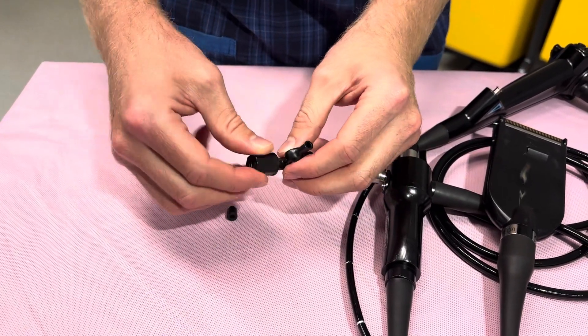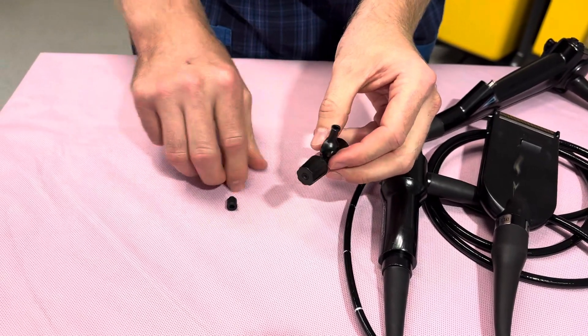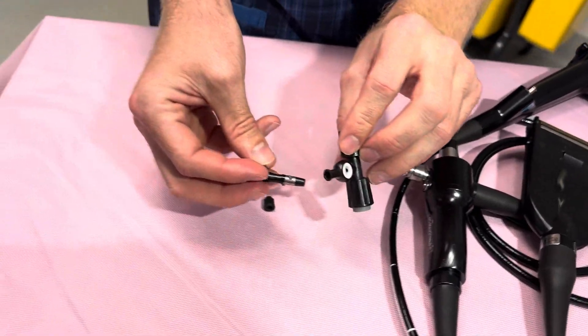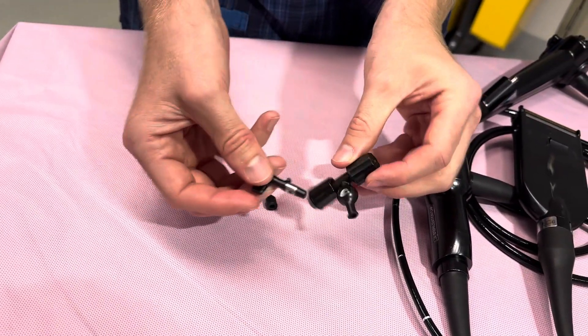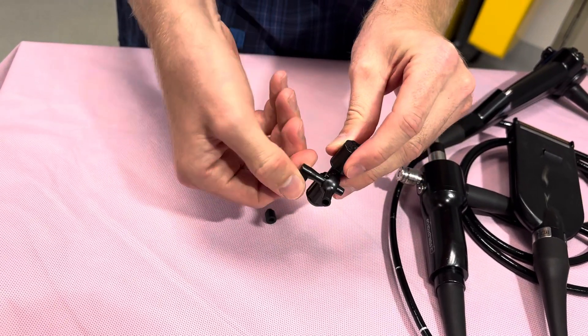The black cap then goes on top and twists down. This will sit only on one side where the notches will only go in one way, so it can sit in like that. That's to help turn the fluid on and off.